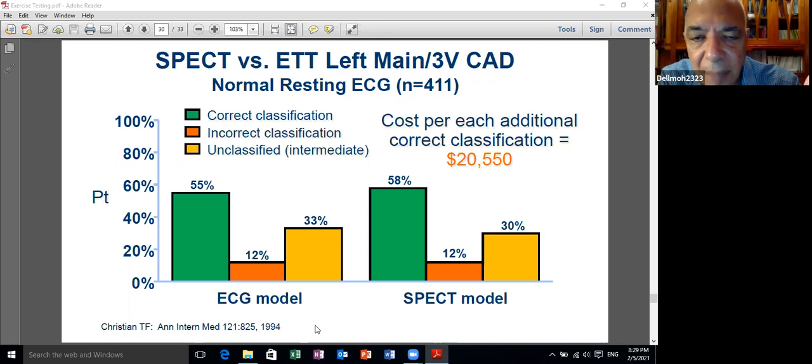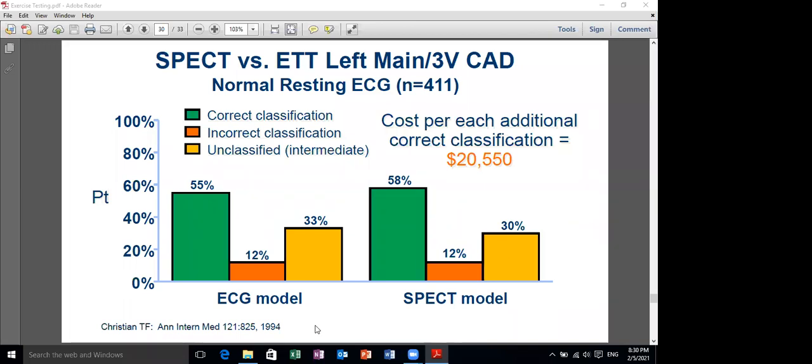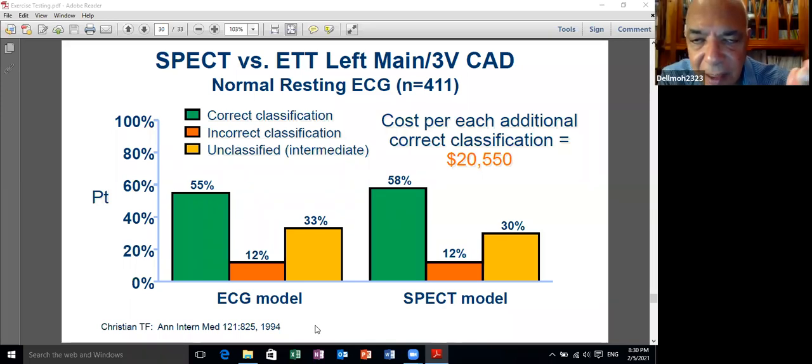كل الستاديز اللي معموله بتبدأ ان ذا ليترشر، وبالتالي الجايد لاينز معموله على الاقل 12 ليد الكتروكارديوجرام. سو الكلام بتاع الدكتور يحيى سعد: في البدايه كانت بعض الاجهزه ما فيهاش الاي سي جي بيرسم 12 ليدز مع بعض، او بيرسم 6 ليدز مع بعض، كان بيبقى فيه 3، ما كانش فيه 3 كان واحد.